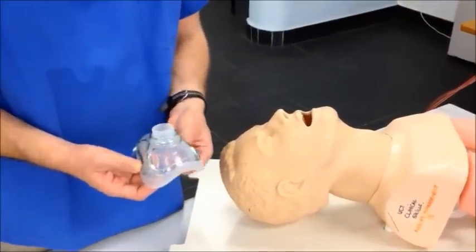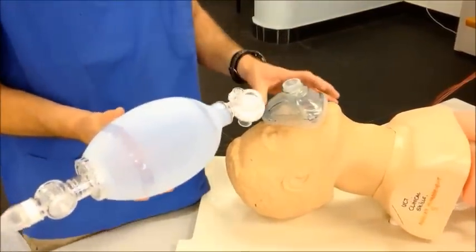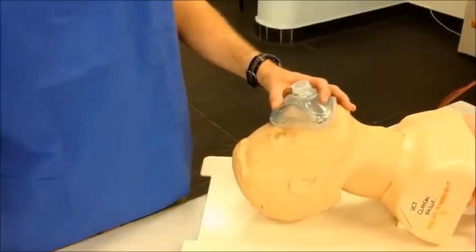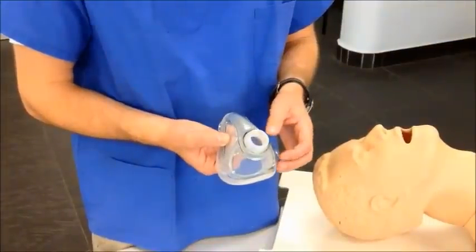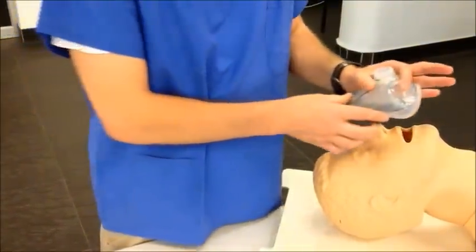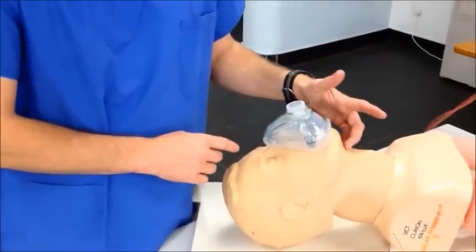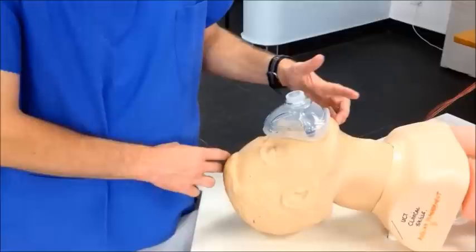If you are a single rescuer, you would often have to secure the mask to the face of the patient with one hand while ventilating with the other, necessitating a good grip of the mask on the patient's face. The CE grip is so named for the components of the grip used to secure the device to the face. The C denotes the index and thumb that surrounds the mask and secures it to the face, and the E represents the three fingers that rest against the mandible of the patient. It's important to note that these fingers should not be resting on the soft tissue as that would close off the airway, but should be on the bony margin of the mandible.